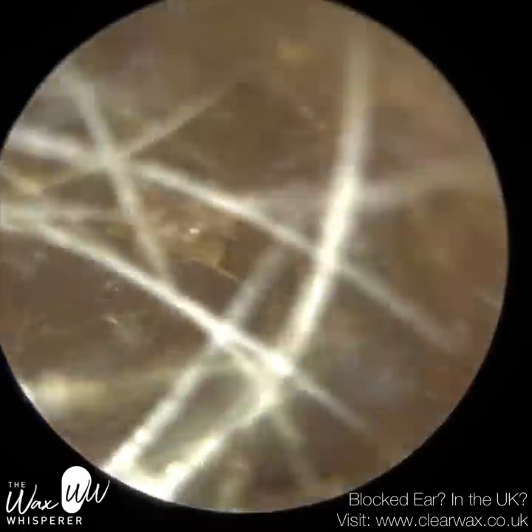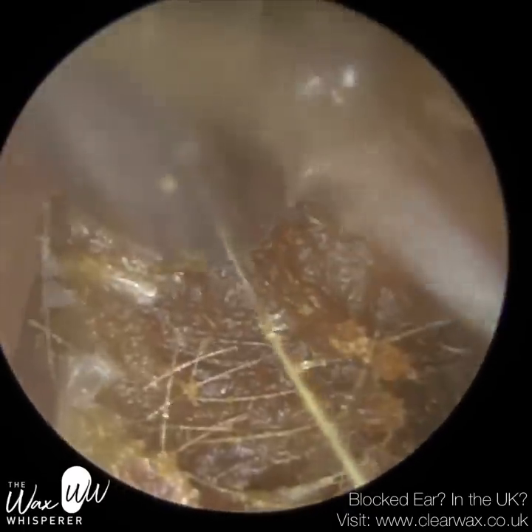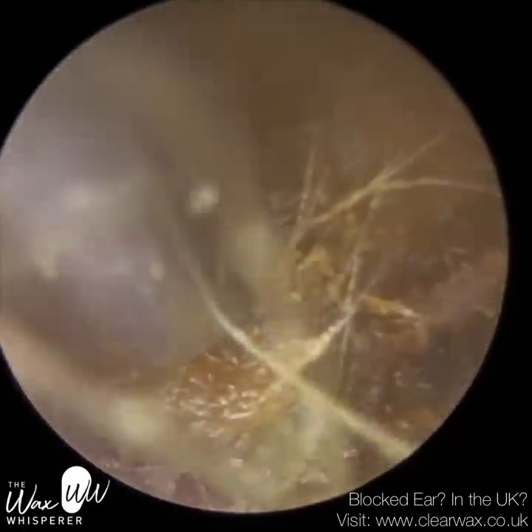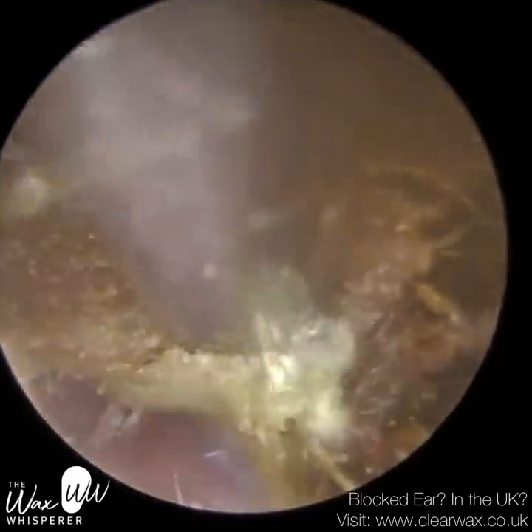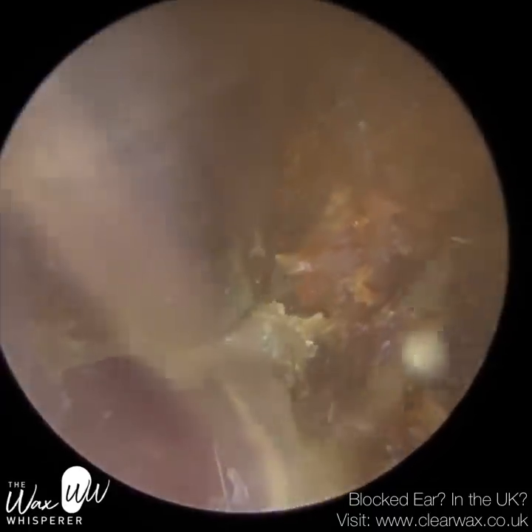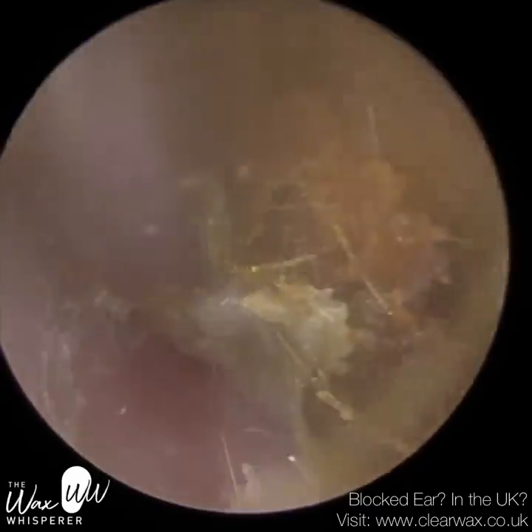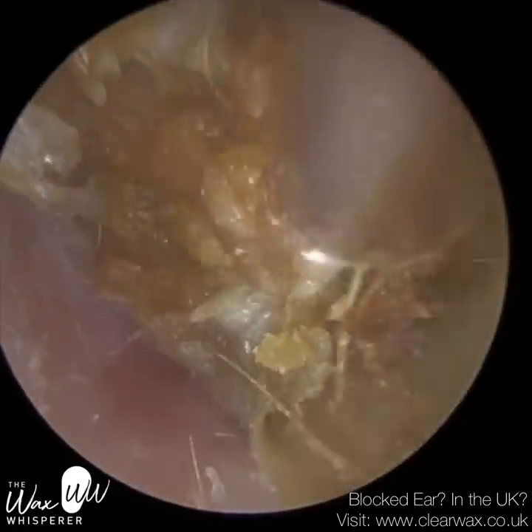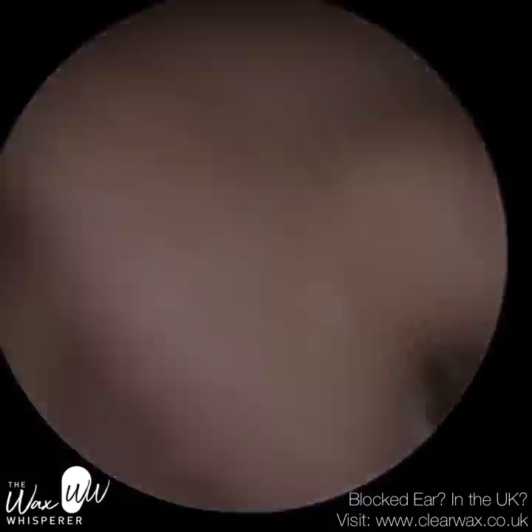The suction probe just got blocked so I'm just giving it a good shake to unblock it. You can see there are quite a few hairs here. There is a bit of a widening of the ear canal, which is sometimes a sign of keratosis obturans. Keratosis obturans is when the dead skin I described earlier fails to fully migrate and forms into a plug. Typically this plug is located deeper in the ear — in the inner two-thirds, the bony part of the ear canal — and more so in the inner third, right up against the eardrum, although it can get bigger and affect the midsection.